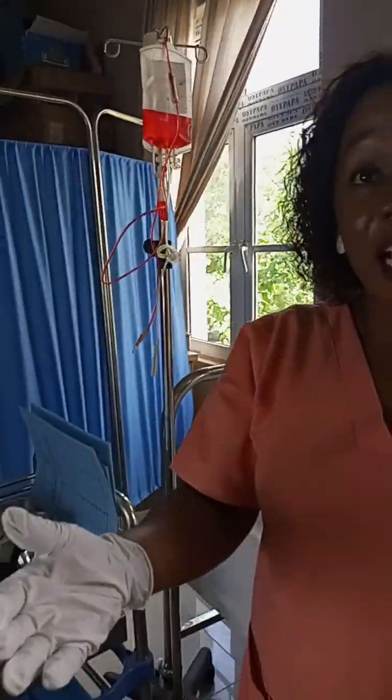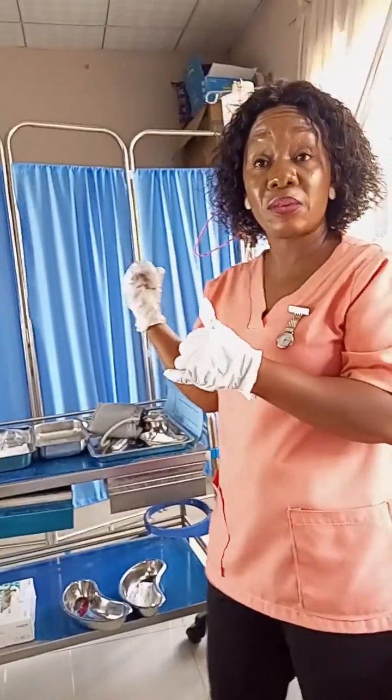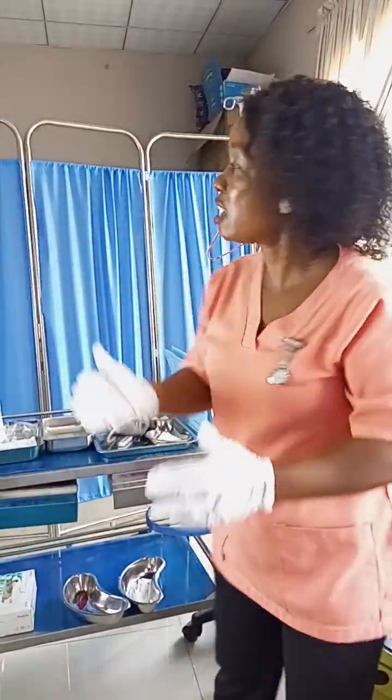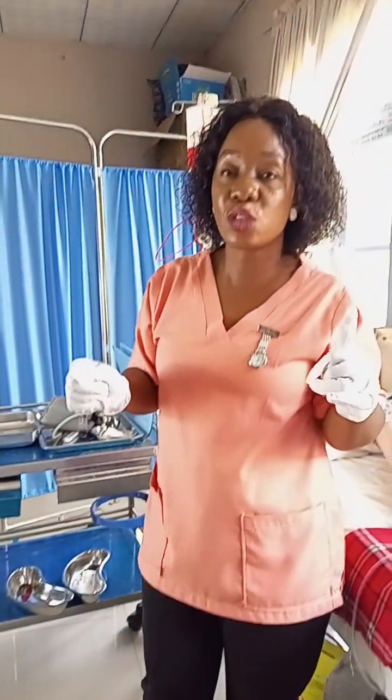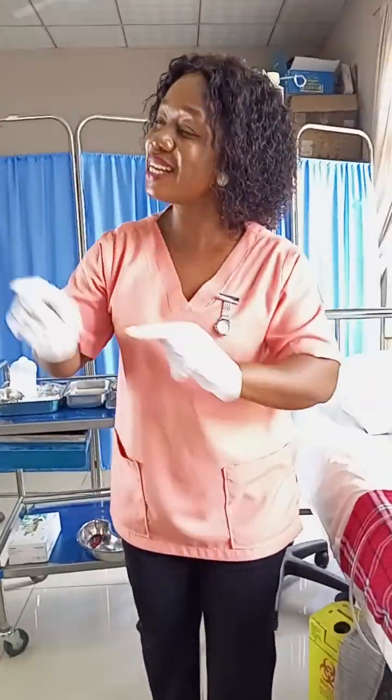And remember, before you hang the blood on the drip stand, please note that if the blood is too cold, do not transfuse the blood. Make sure that you bring the blood to room temperature. For you to achieve that, please put the blood under running tap water. Do not microwave it. Use running tap water to bring the blood to room temperature.